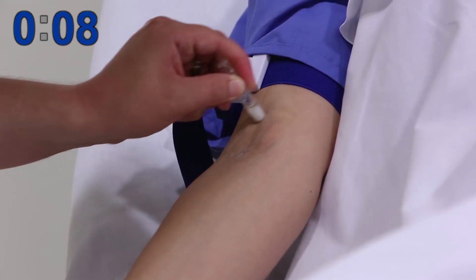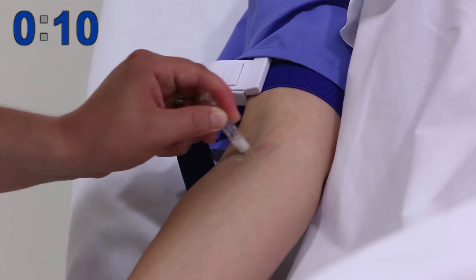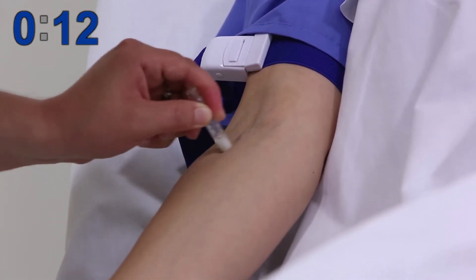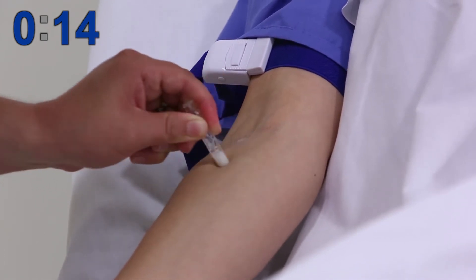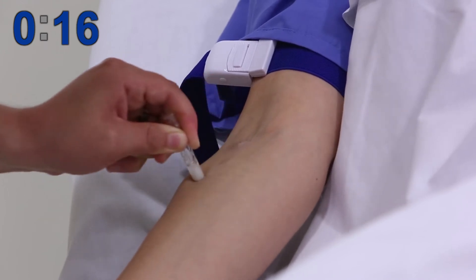You must allow the liquid to dry in order to kill any organisms on the patient's skin. Chlorhexidine is preferred to iodine in view of its residual antiseptic effect and faster drying time.